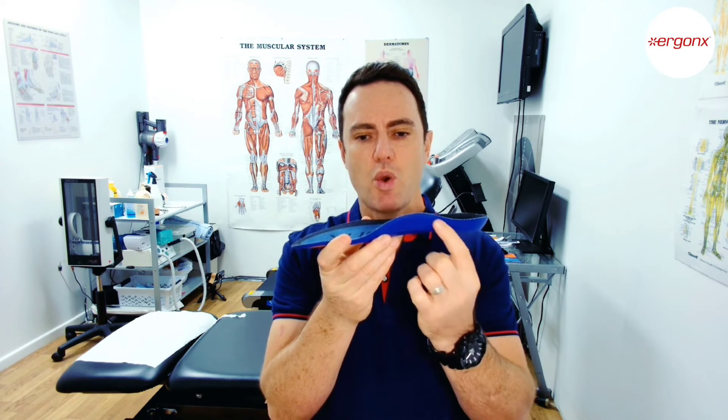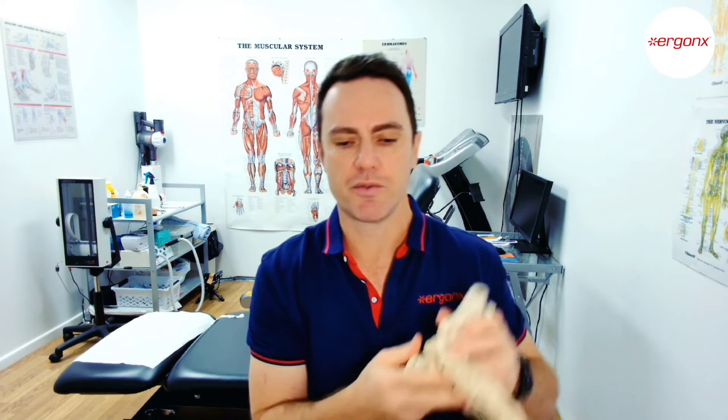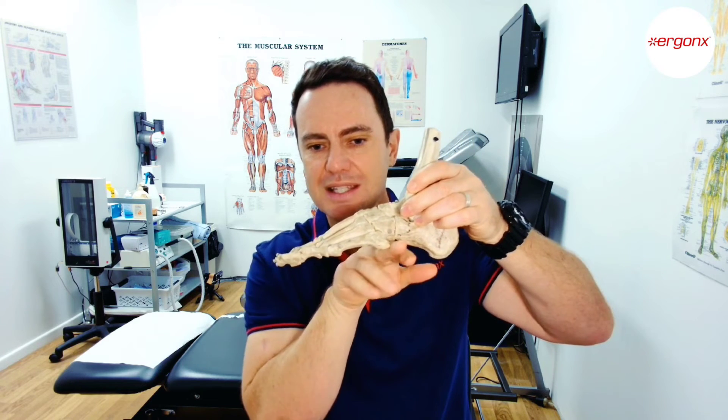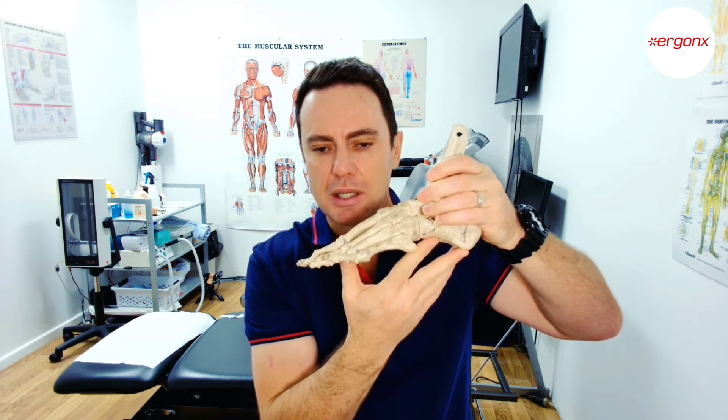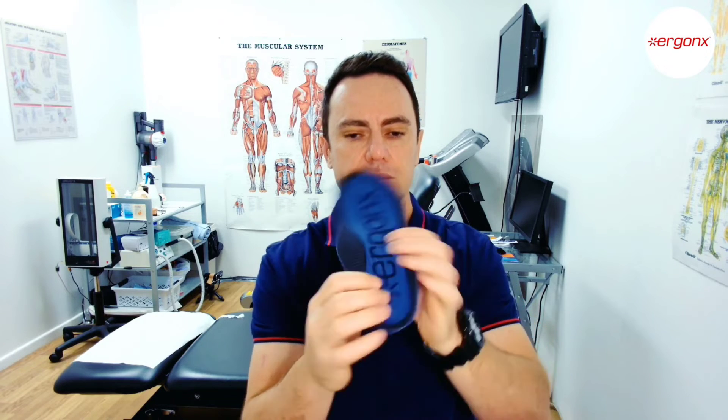So what we do is put an orthotic inner sole like this one here into the work boot. It supports the arch on the inside, and there's also a lateral arch support because there's an arch to the outside of your foot too. If we look at our foot model, everyone knows the arch down the inside of the foot, but there's also a little arch down the outside that will actually collapse slightly when your foot stands on the ground. So we support both arches — inside and outside — which stops the foot from rolling in too far and also from rolling out too far.